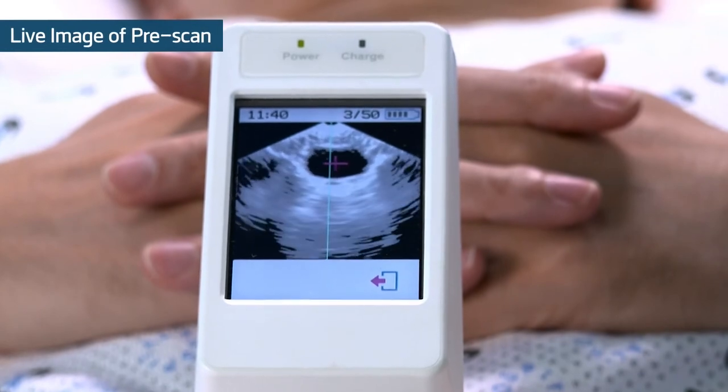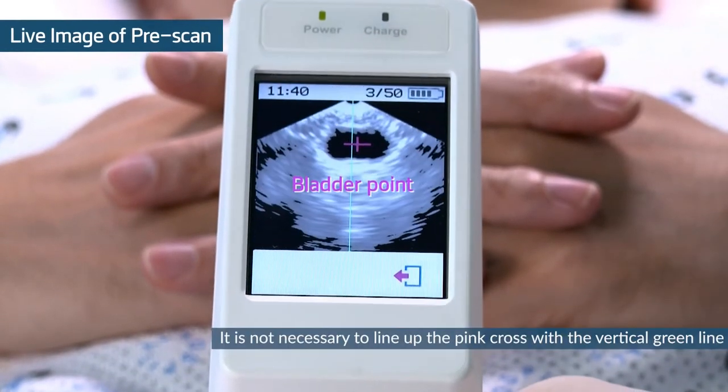During the pre-scan, the bladder point and green line will help to get an accurate measurement.